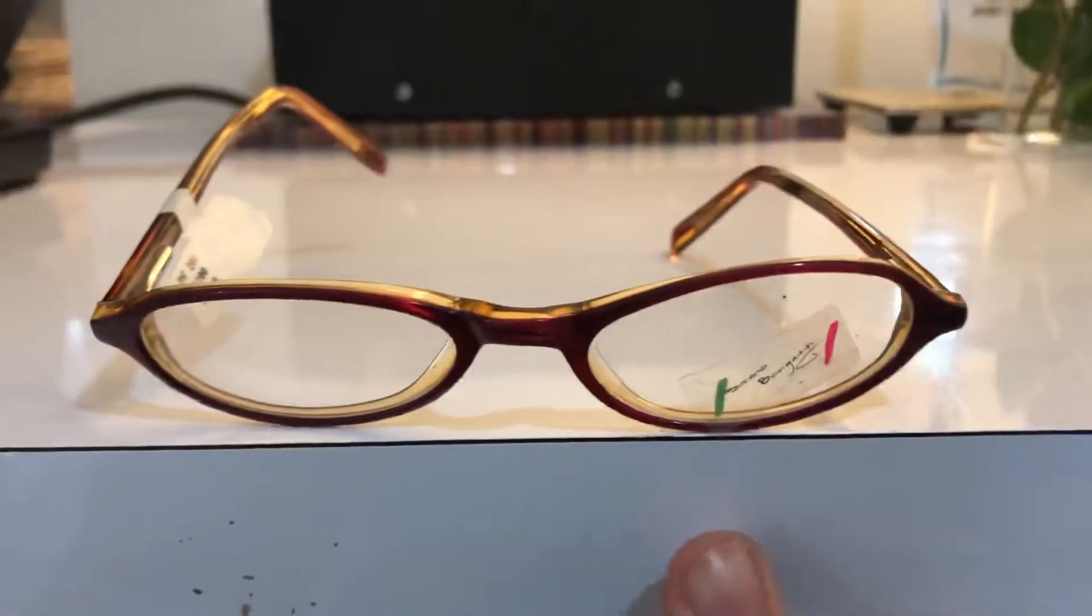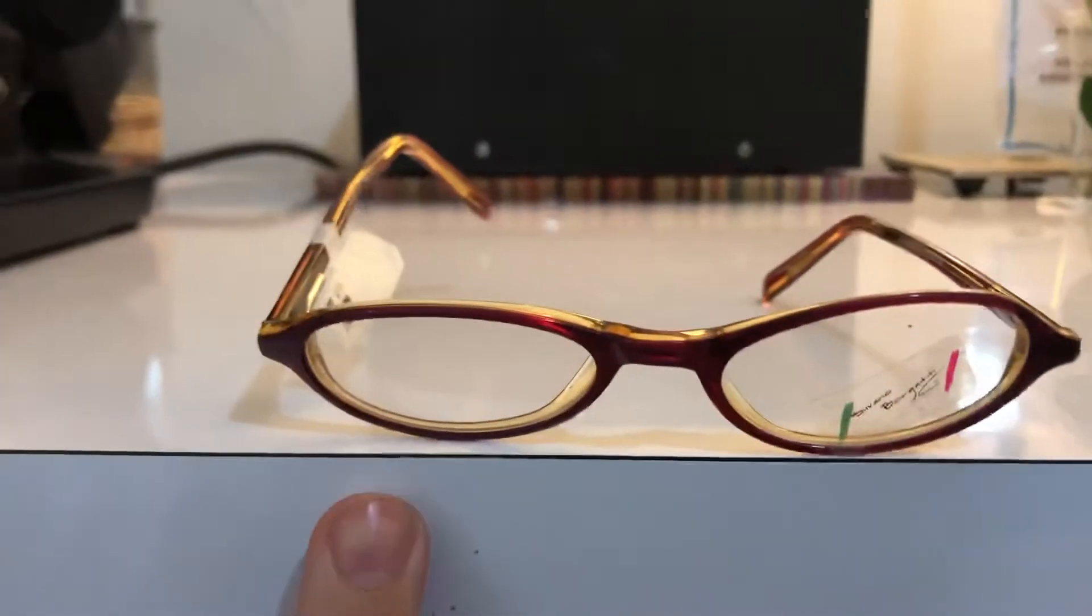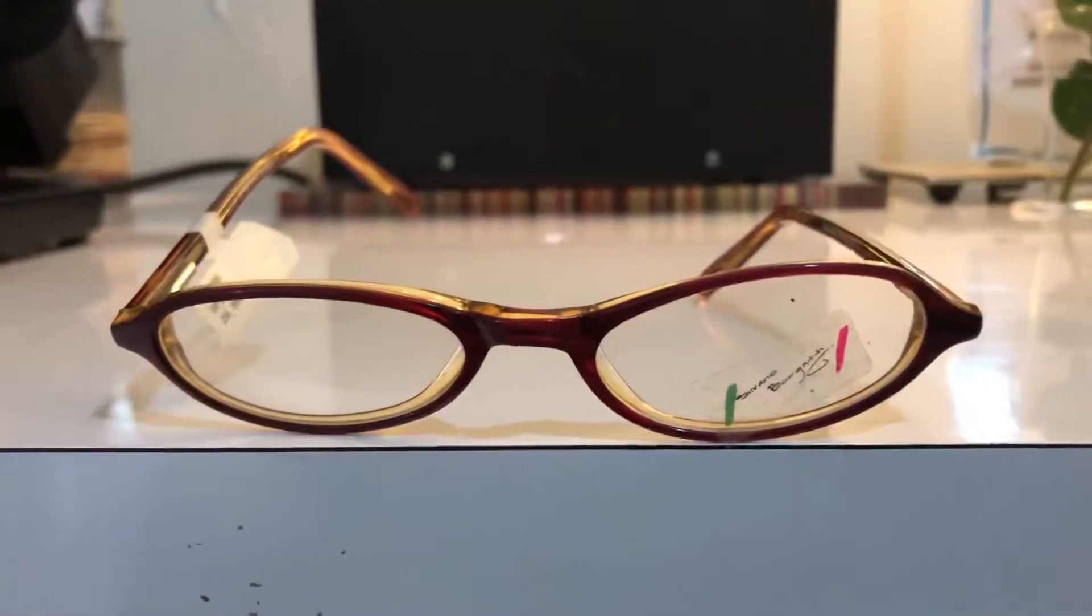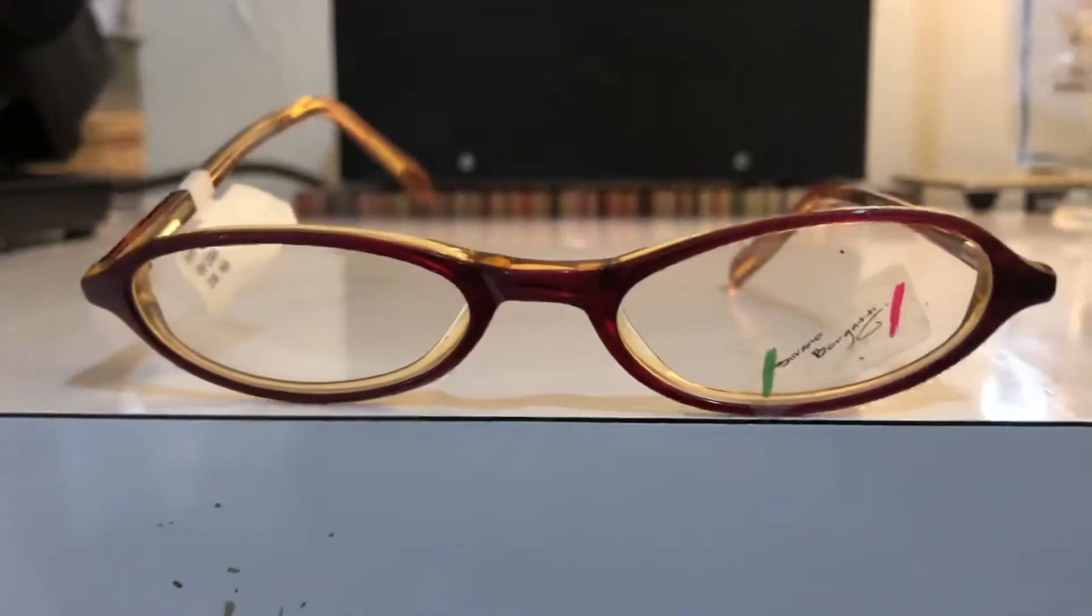This lens on the right is more forward than the one on the left. So this is called X-ing. In order to adjust this, you have to heat the bridge and we're going to push this lens back and this lens forward.